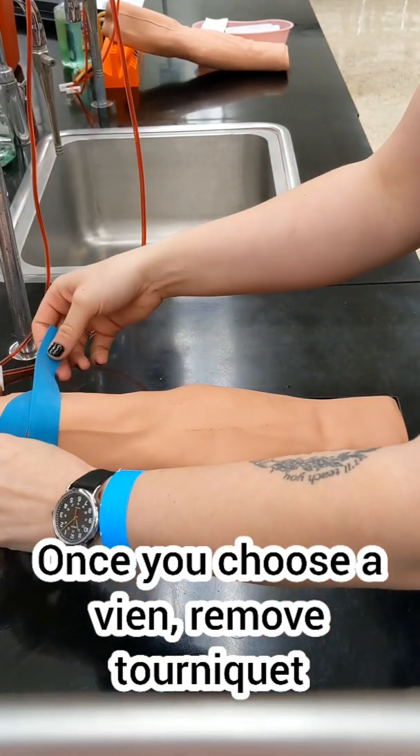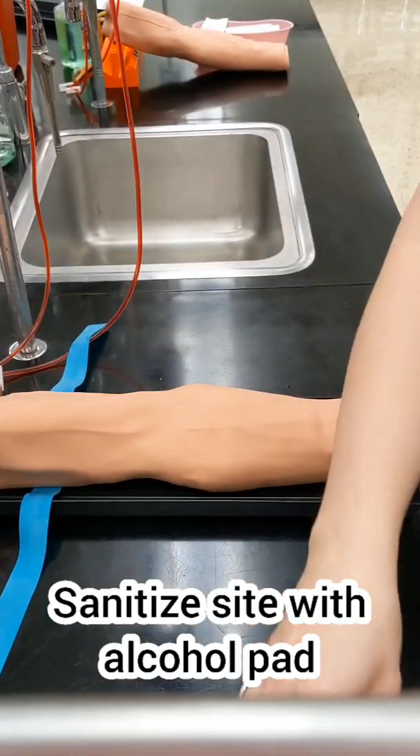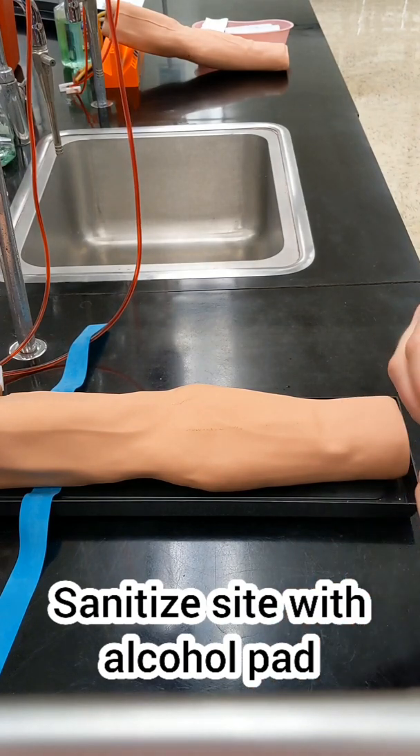Remove the tourniquet before prepping the site. You don't want to leave it on for more than one minute, because that can alter your test results.